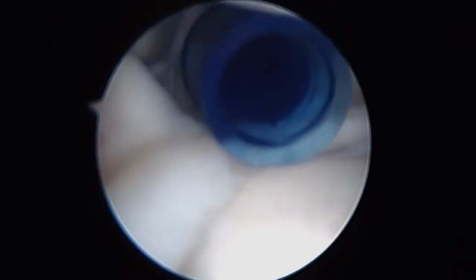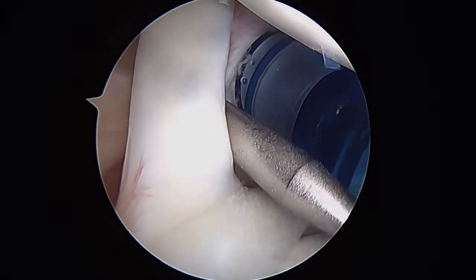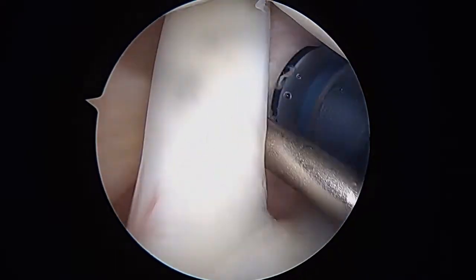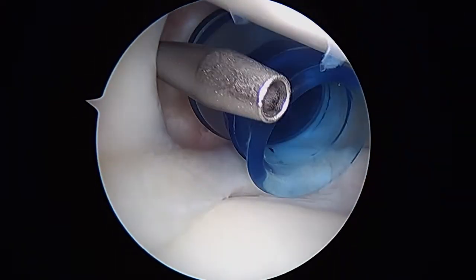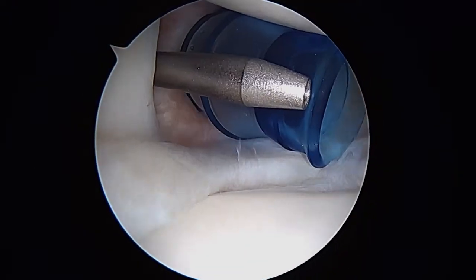Hi, it's Dr. Buford. We're just getting started on the right shoulder here. We examined your shoulder before we started and it was very unstable in virtually every direction we tested it, both to the front and to the back. And now we're getting our first look inside the joint. I just wanted to show you this before we move our camera to the front.